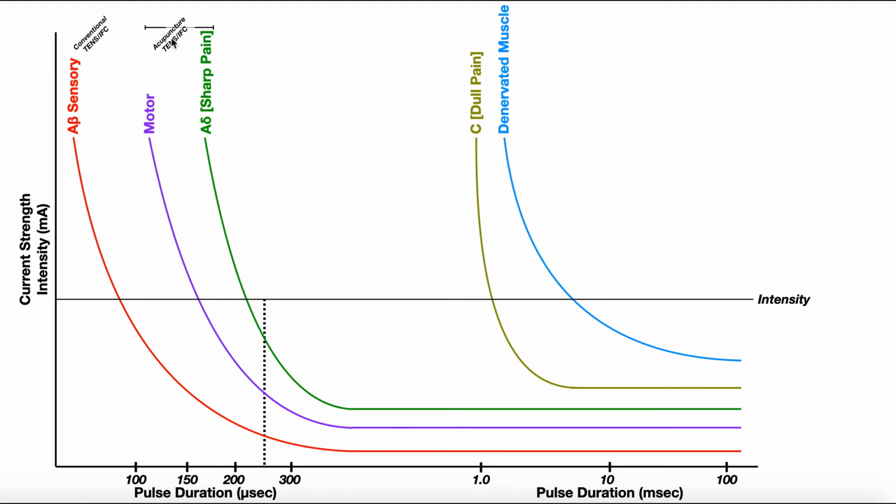So when you're doing acupuncture setting here, depending on individual differences and the exact part of the body you're doing it on, the size of the muscle, you're going to get multiple things. You have to get the muscle contraction. That's the whole point of the acupuncture. Okay, so you're going to get that. But you may get some sharp pain associated with it, and you may get some tingling. Okay, but the most noticeable things are going to be that muscle contraction and the sharp pain.